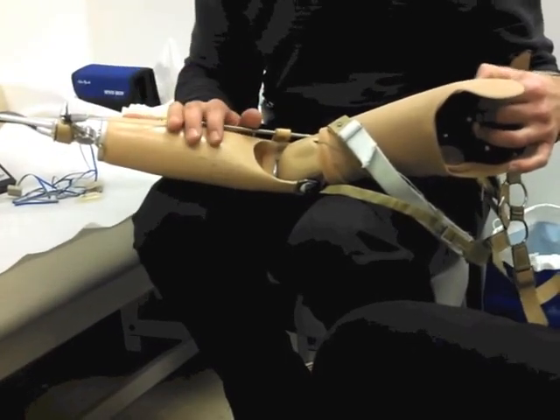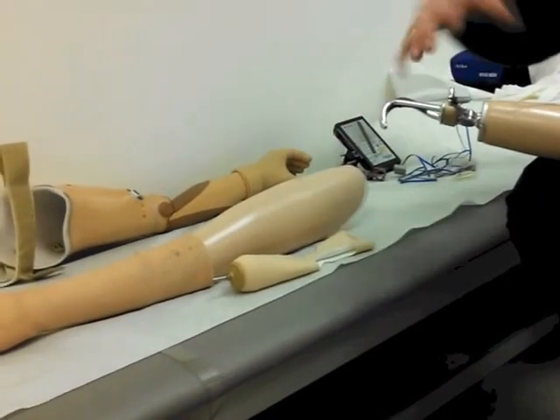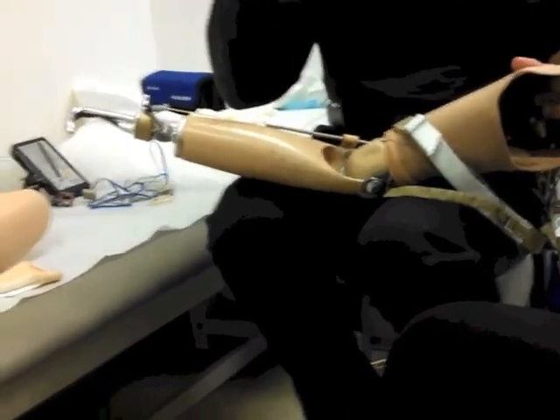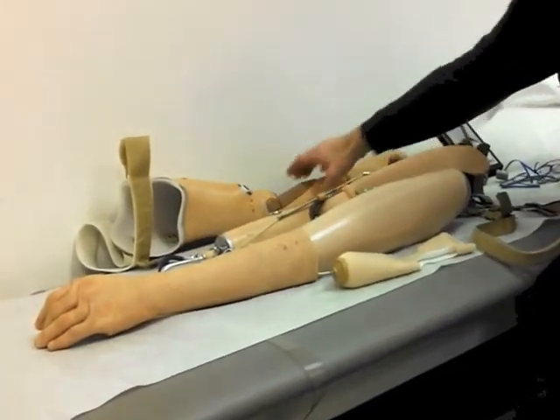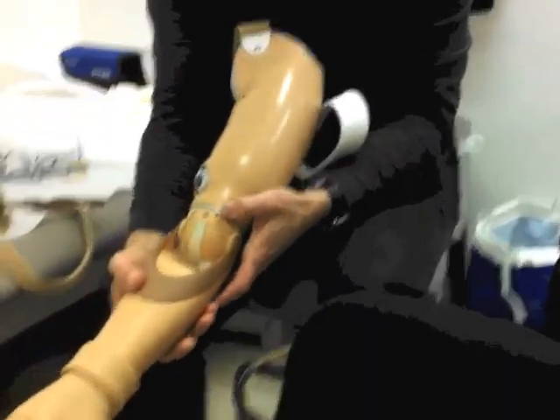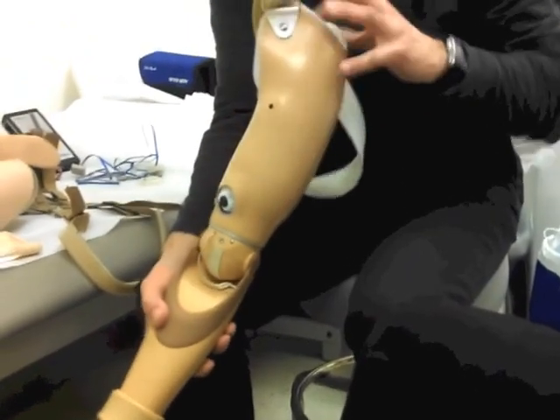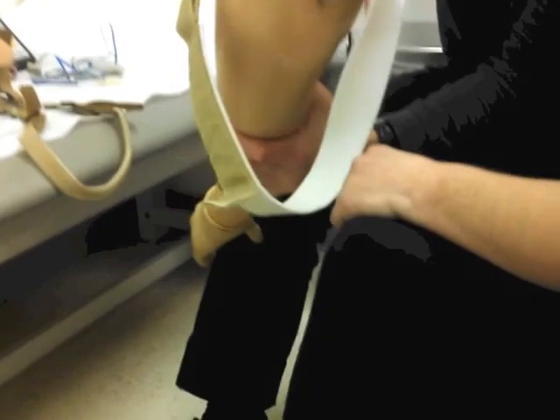It's a prosthesis that works off of basically a muscle — when you fire the muscle, it activates the elbow, the hand, and the wrist. There's a little button here and it just powers it on, and this is already powered up. There are two electrodes inside here, and I have the myotester here — I can check you a little bit.